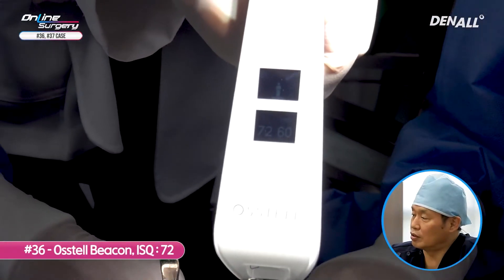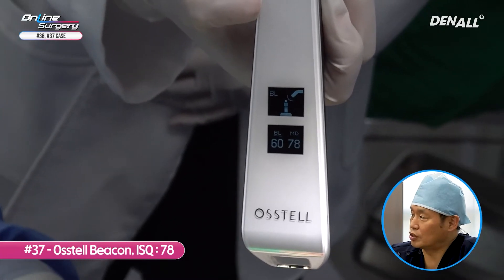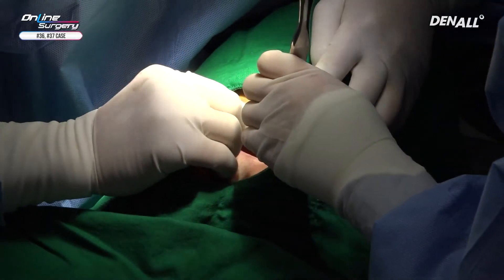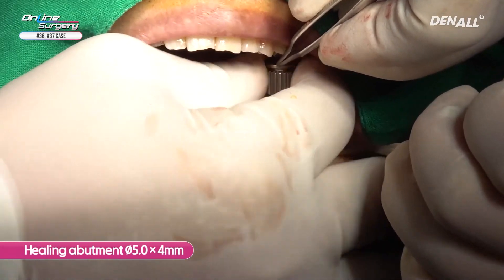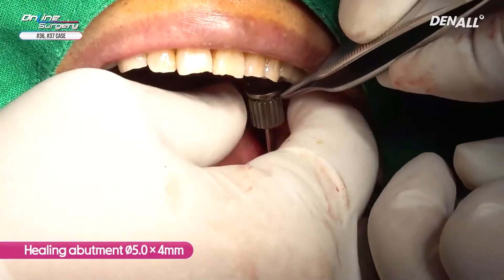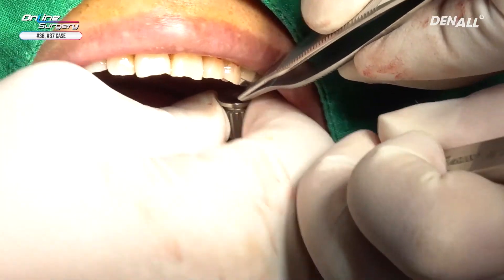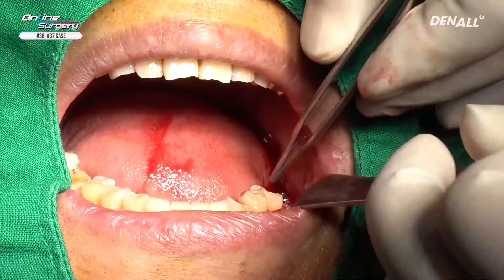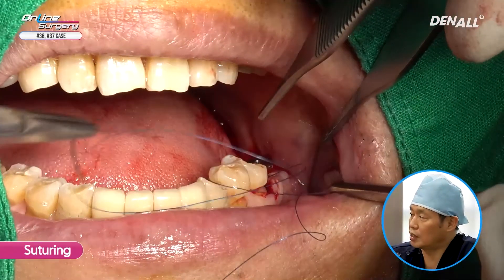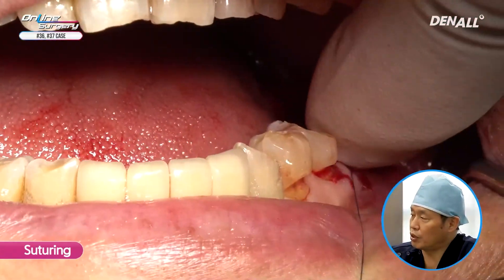In the case of number 36, the ISQ value is 72. In the case of number 37, it is approximately 78. Healing abutments are connected and interrupted suture is done. I did not open the flap significantly and therefore there is no major issue in suturing.